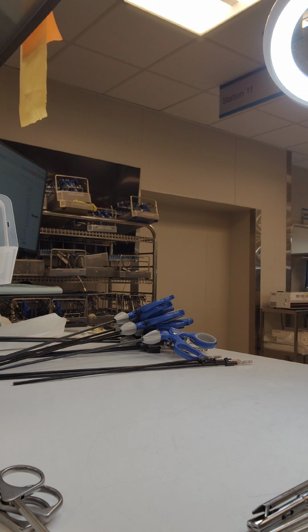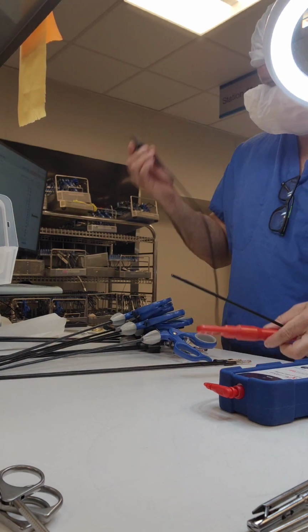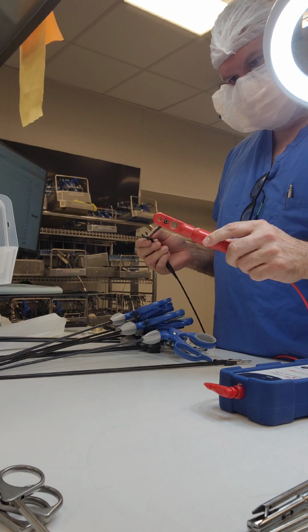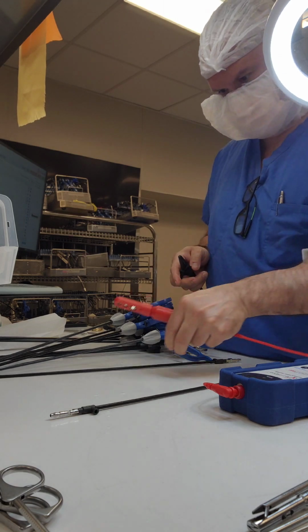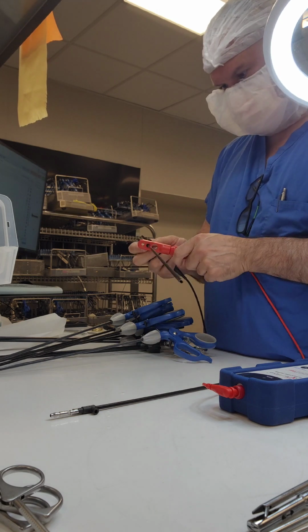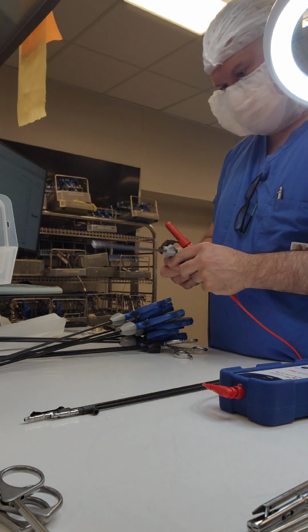All right, moving my instruments off to the side. Let me go grab my lap tester. I wanted to show you guys this on screen because I usually do it on a back table if it's available for me, just to free up some space. So again, simple test here: lap tester on, connect the alligator clip to the metal, and then place it in the proper size diameter. Now you see how quickly I lap test this. It doesn't have to be a slow process, guys. It doesn't have to be slow motion. You see that one failed right off the back. I had one that failed. Put that off to the side. You're going to know right off the back when you get one that fails.